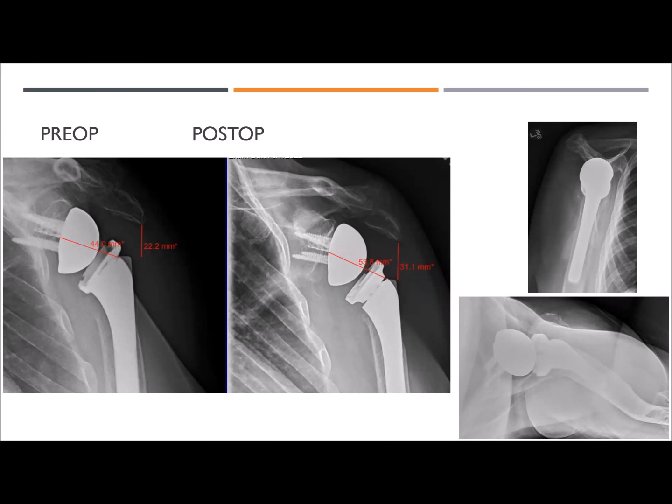His displaced scapular spine or acromion fracture was probably at least contributing to his instability problem, but he wasn't having pain there, so I felt it was not necessarily the right idea to attempt to fix that, given the complications associated with it. This patient already had the largest glenosphere.